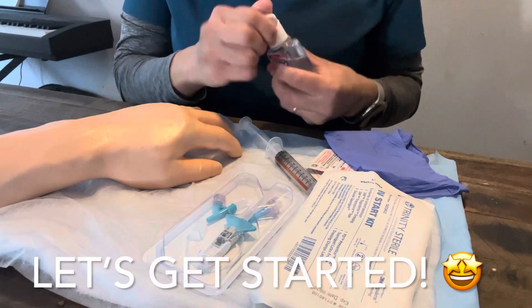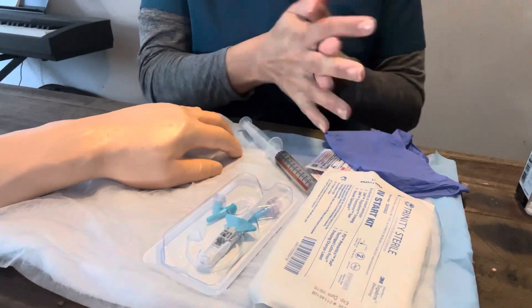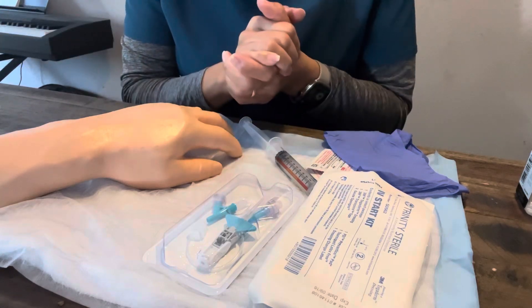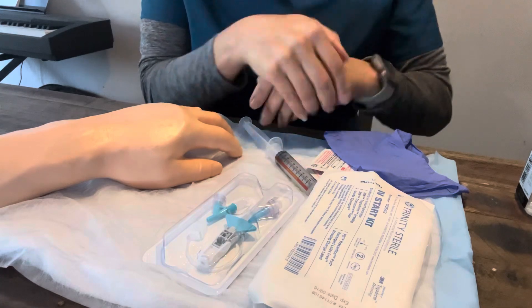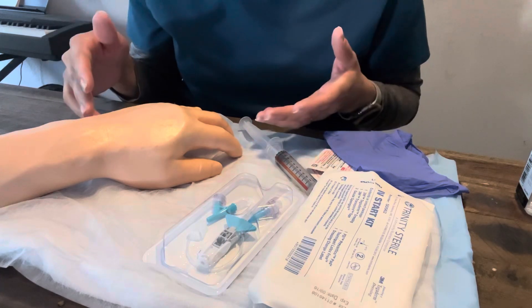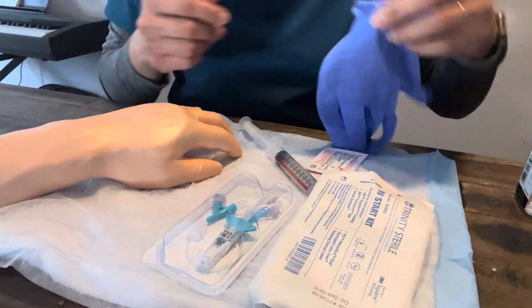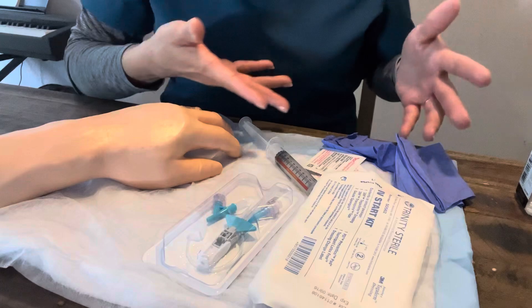We'll start by hand sanitizing — rubbing either hand hygiene at the sink or as you're coming in the door, scrubbing and rubbing for at least 30 seconds. We've already checked our orders. We've identified this is the patient. We have an order to start an IV. The patient's being admitted to the hospital.